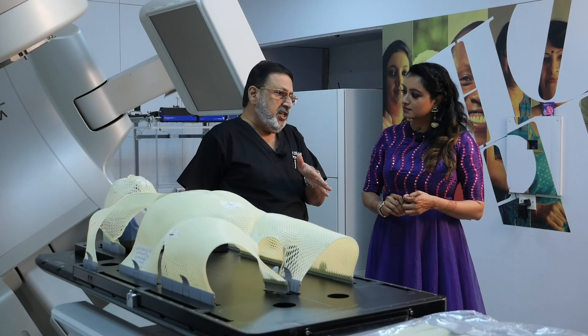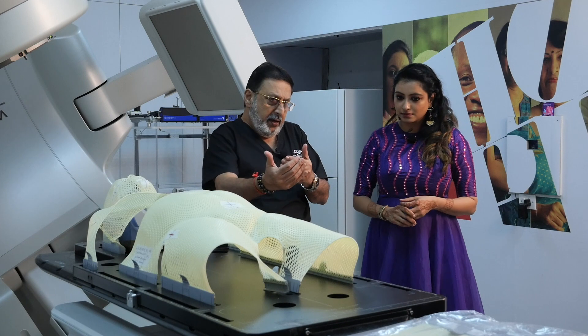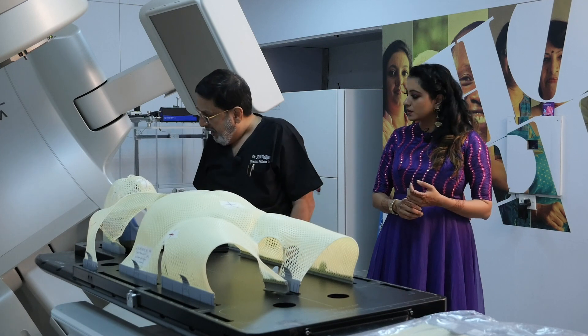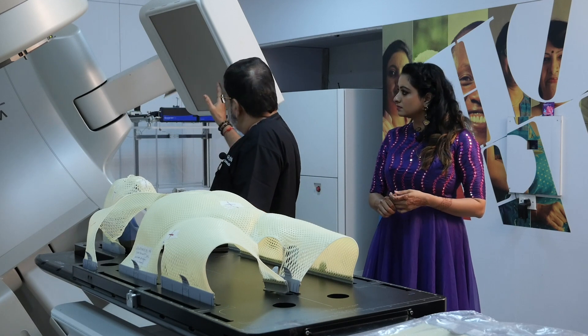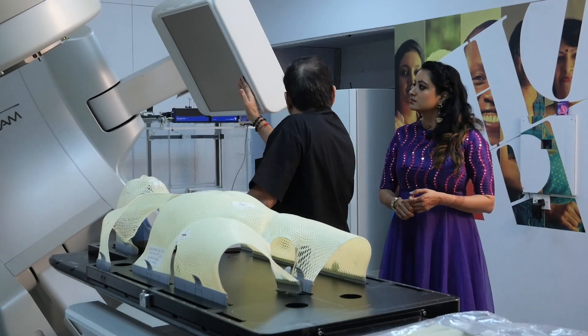When the radiation strikes, or the electron strikes the target, then what exits out from here is the radiation. This is what you call the head of the machine, and this is the body of the machine, which has two imaging devices on either side.